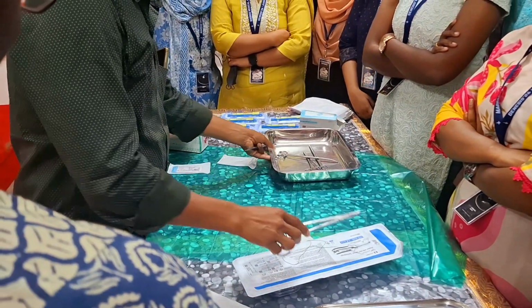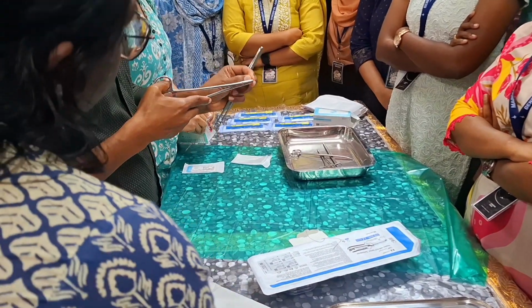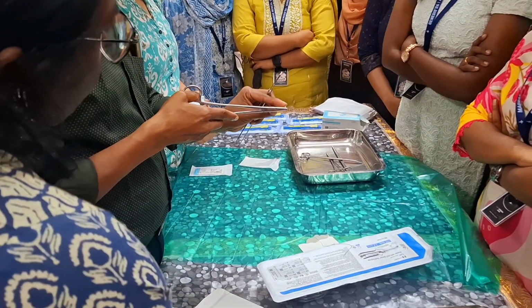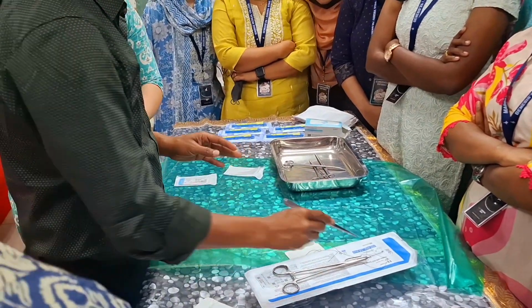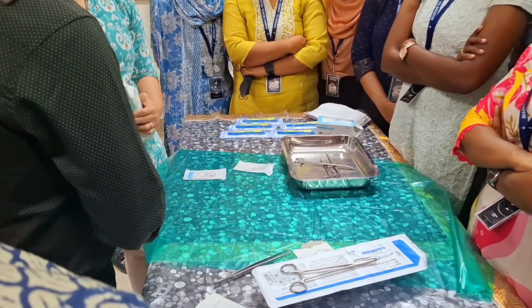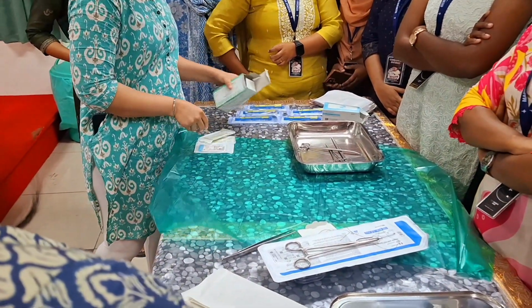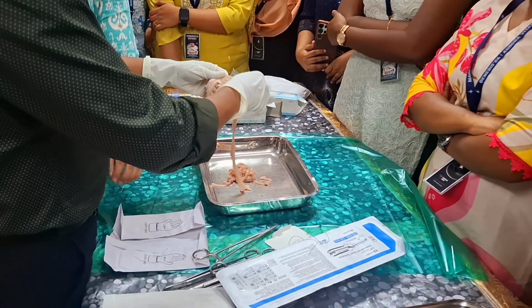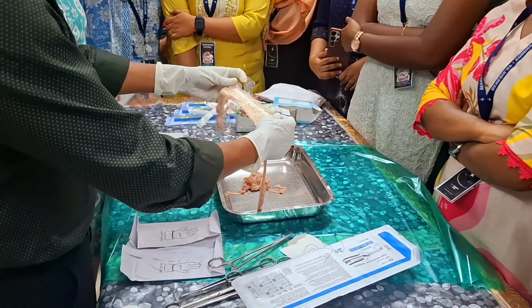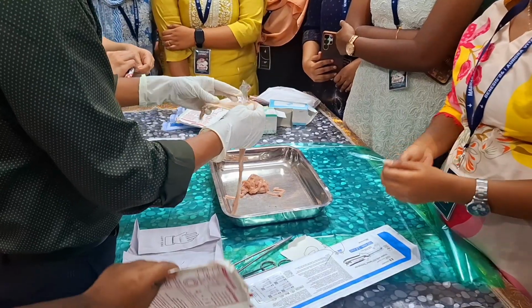So what is the exercise? Before doing, you have to place the needle like this. Sorry, the tip is on the... Hold the ball. Hold the ball.